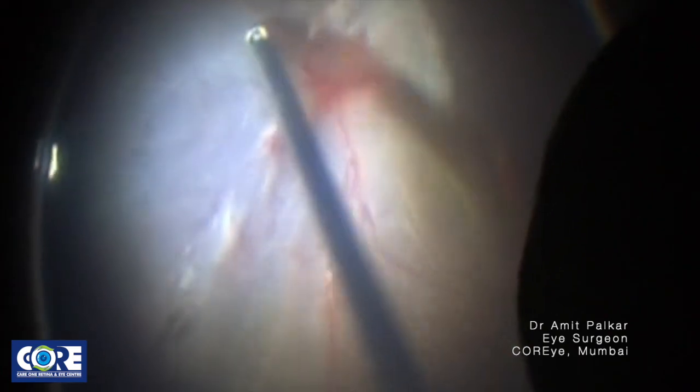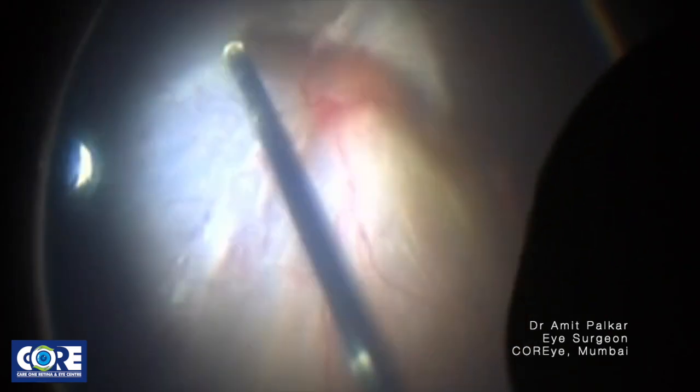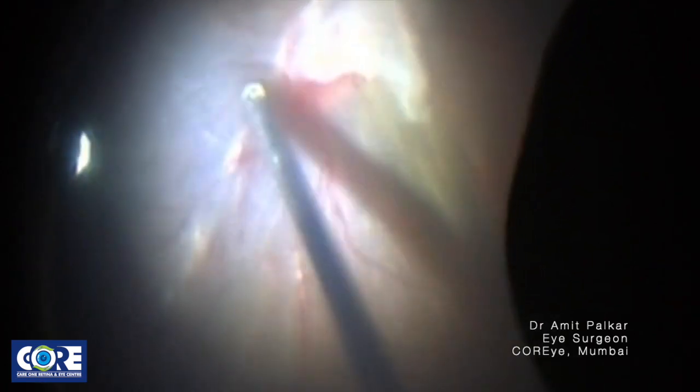So now I'm beneath the attached hyaloid in the plane and trying to lift it up with the cutter and free it from the retina and cut it one at a time.